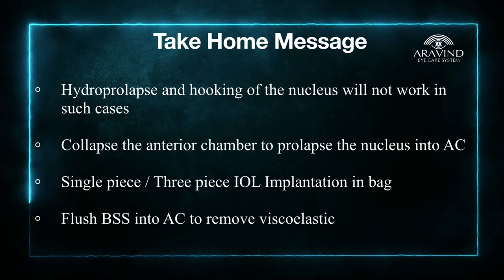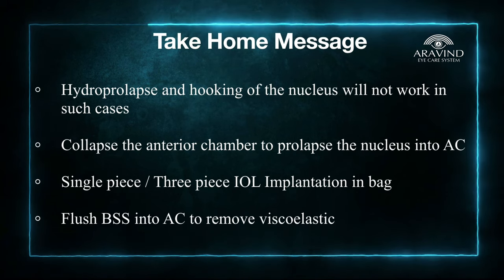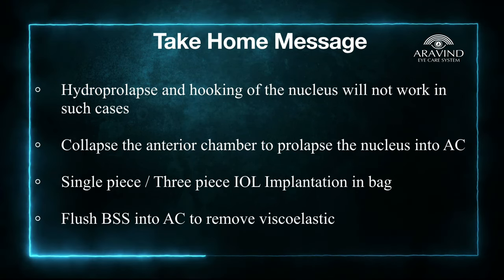Do not aspirate viscoelastic closer to the endothelium. Instead, flush BSS into the anterior chamber to remove the viscoelastic sticking onto the cornea.